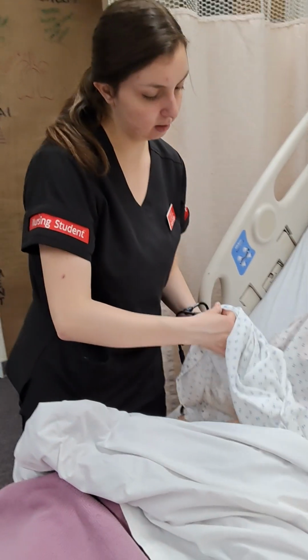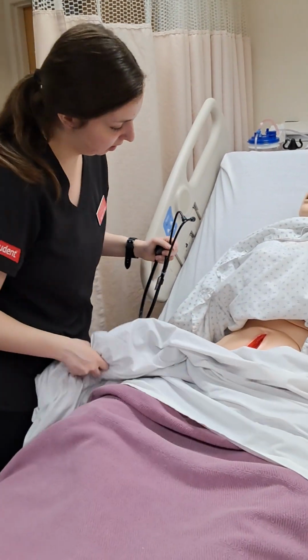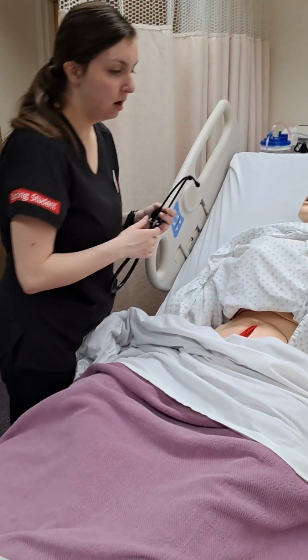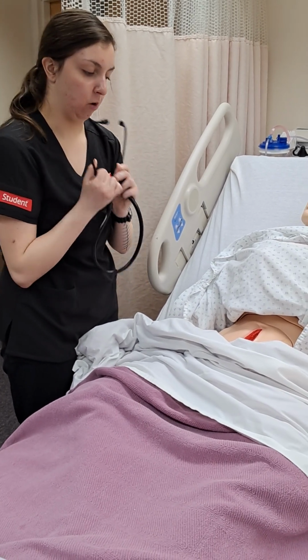I'm going to inspect. I do see that he is distended, and now I'm going to auscultate for 1 minute in each of the quadrants unless indicated otherwise.